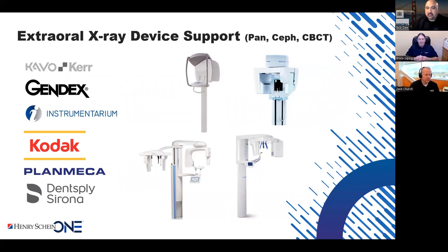When other companies talk about integration, everybody integrates, but not direct integration without using Twain software. Now, Twain software is fine for certain things, such as an intraoral camera. But my experience has been that for X-rays, direct integration is usually best.